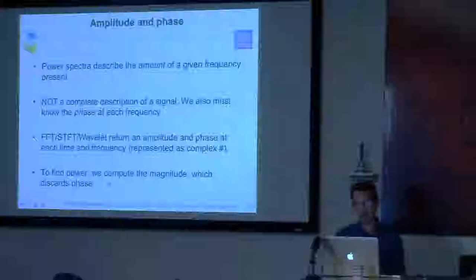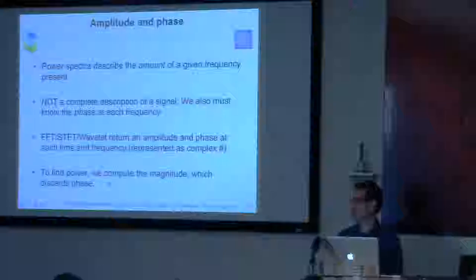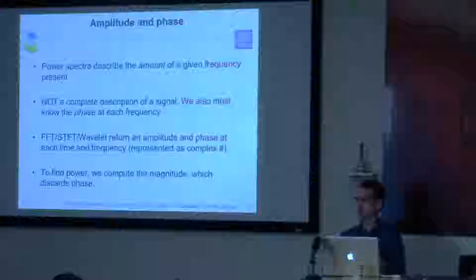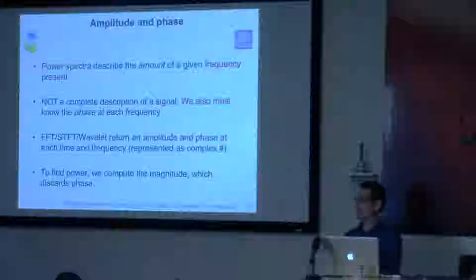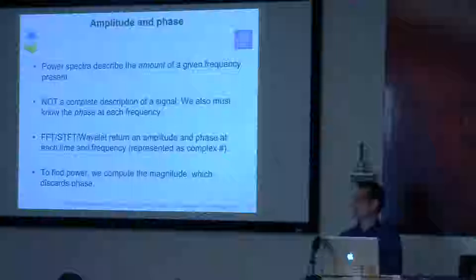I'm reiterating this because it's an issue that I find some people beginning frequency analysis don't quite appreciate, that underlying the plots that we show in EEGLAB, there's actually this complex valued representation. In the spirit of EEGLAB, which is to throw out as little information as possible, like doing an ERP, you're getting rid of lots of interesting brain processes. Just keep in mind that looking at a power spectrum, you're actually ignoring part of the information.